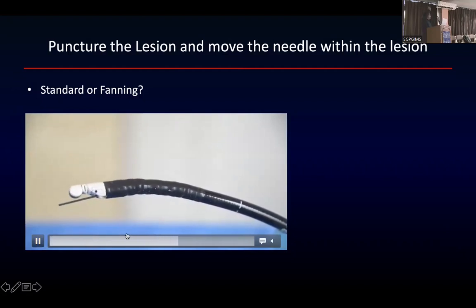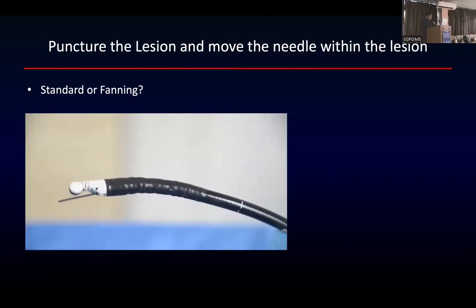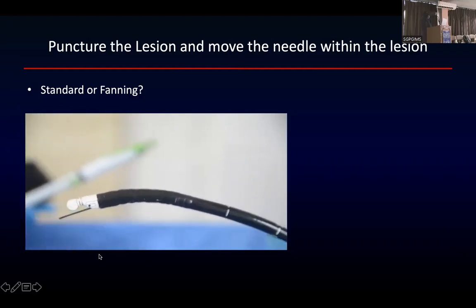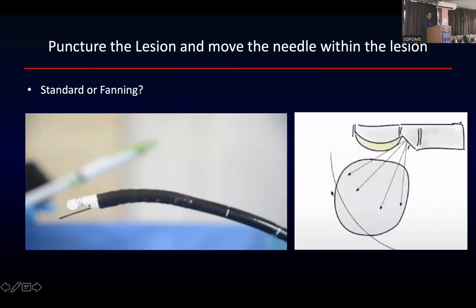आप पूरा lesion के बाहर नहीं आए. You haven't come out of the lesion. You are just adjusting the site. So you have something like this. Yeah, something like this. Okay.